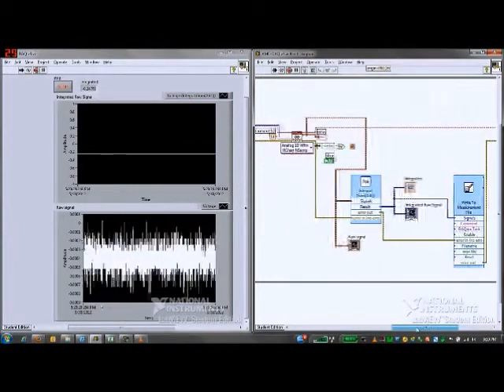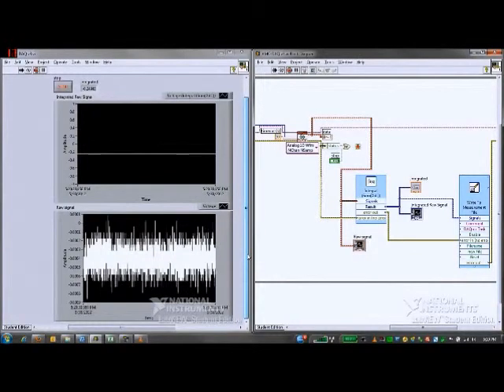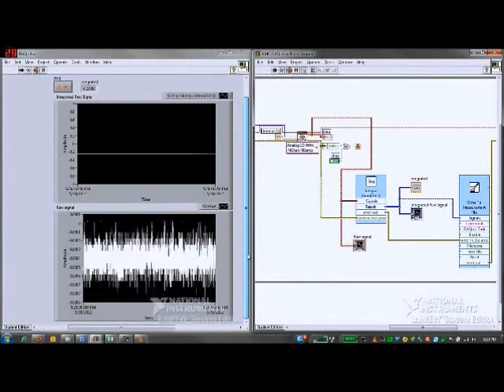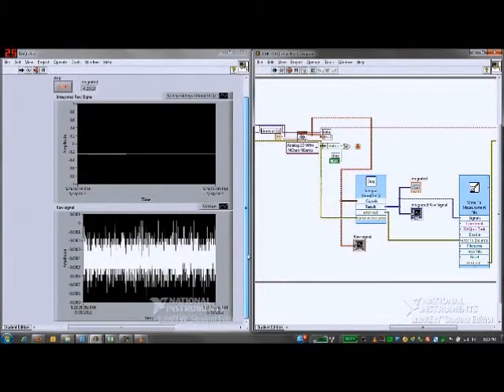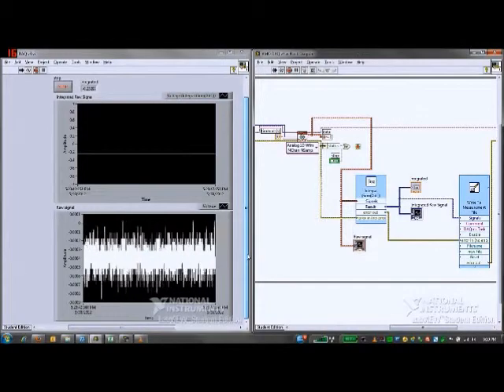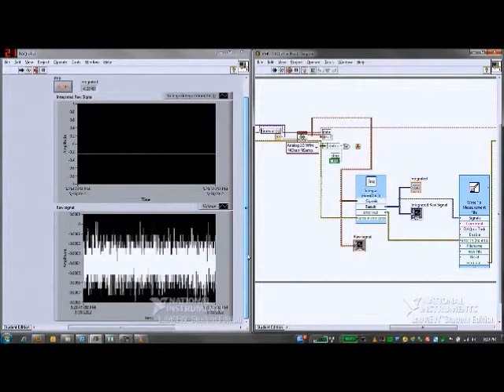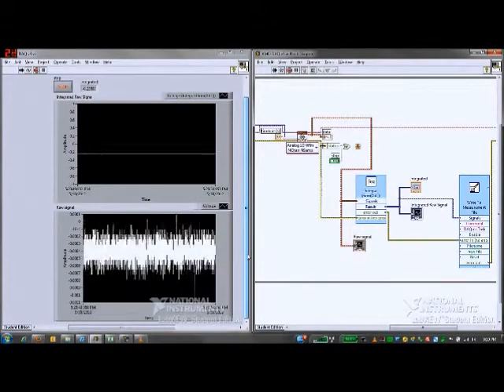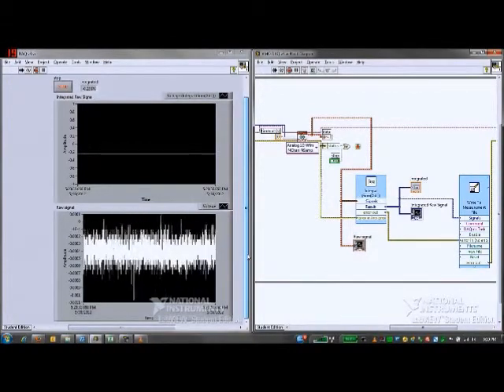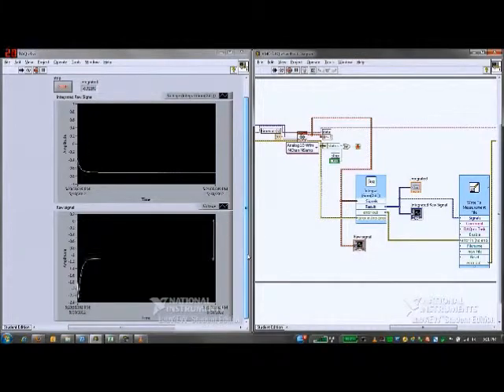The reason we are integrating the data is because at AMO, the pressure probe does not give out actual pressure readings, but rather changes in pressure. So to get the actual pressure readout, we must integrate the signal. I'm going to plug this into my iPhone real quick so you can see what the peaks look like and what the actual, well, it's going to show voltage, but not actual pressure. But you can see the peak going on the bottom, and it's integrated on the top, and then being removed, and then on again.